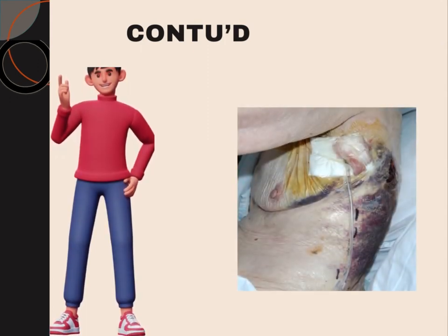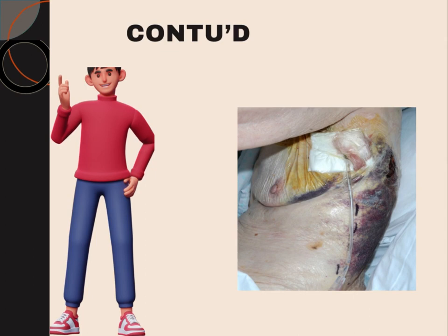If you're doing the procedure, you need to be very careful while securing your drain, because sometimes we noted the drain is hanging outside and not properly secured. Even sometimes in pleural effusion, there could be dribbling of fluid outside, because we are making a proper track and giving a route for fluid to come out. So wound infection is very common, and you can see the ecchymosis over here on the back, which could be a complication, depending on whether the patient was already on anticoagulants or not. For these sorts of post-procedure complications, we need to be very careful.